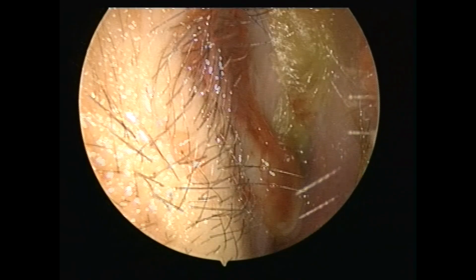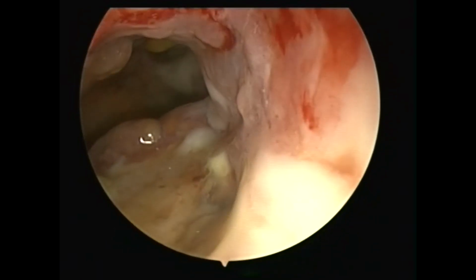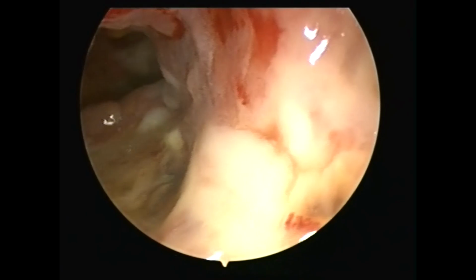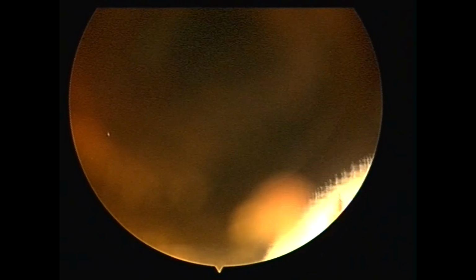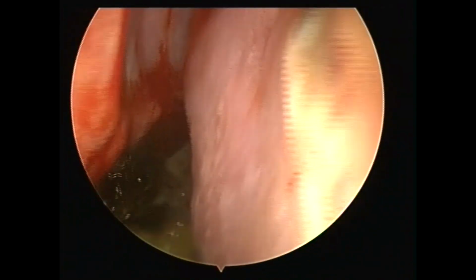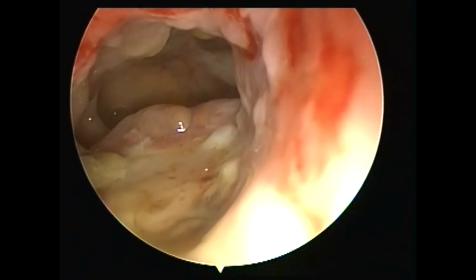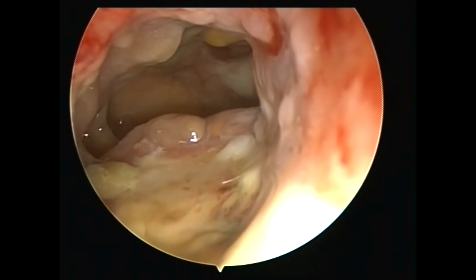Now I'm shifting onto the 70-degree endoscope and I'm trying to show you the patient's frontal sinus opening. As you can see, that's the patient's frontal sinus opening. If you've seen the surgical video, at the end of it I had managed to open the patient's frontal sinus. It's a very huge frontal sinus opening, and this patient had a very boggy edematous mucosa, for which I started the patient on steroid therapy of 21 days with tapering doses, as a result of which you can see the mucosa has undergone severe reduction in swelling, and you can see a huge opening in the frontal sinus right now.